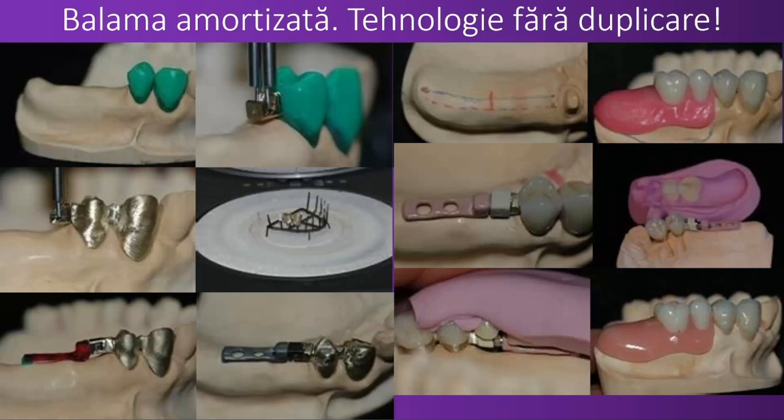That's very interesting. So once those are cast, this is the golden variant. You see, this can be fixed there. You can use a parallelometer, but it's not important because it's unilateral.